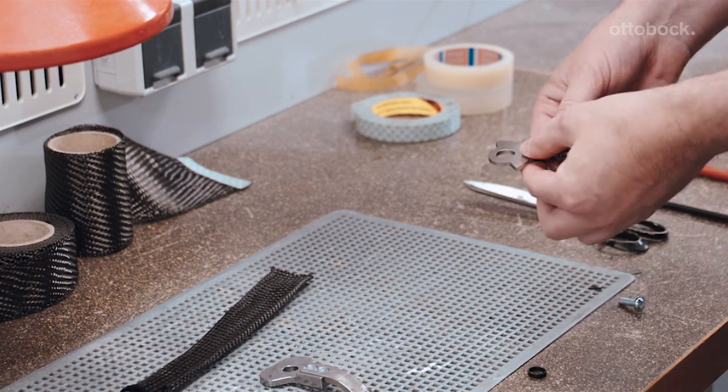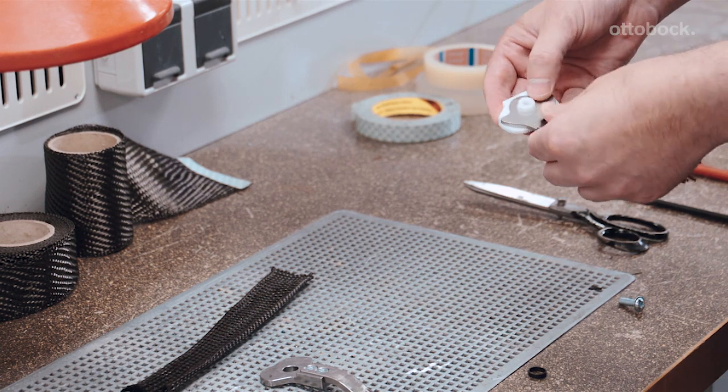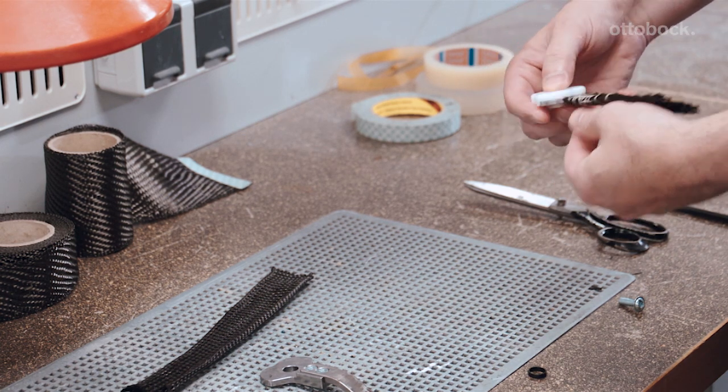Important: set the bearing bushing aside in a safe place and reinsert it in the foot stirrup prior to final assembly of the orthosis.